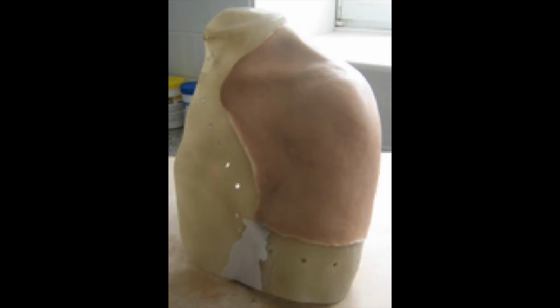It did fit up high around my neck, which is very tender from the surgical site. I just did not find it comfortable. It was hard, it was not flexible, it did not mold to my body. I just did not care for it. And so I had to search elsewhere for something that would be comfortable, that I would be willing and able to wear.